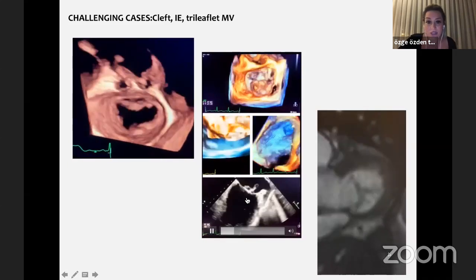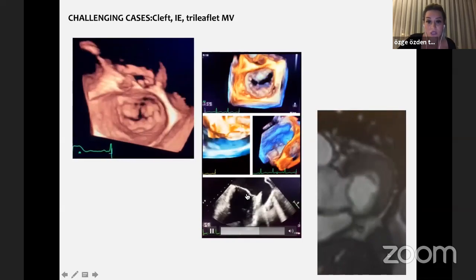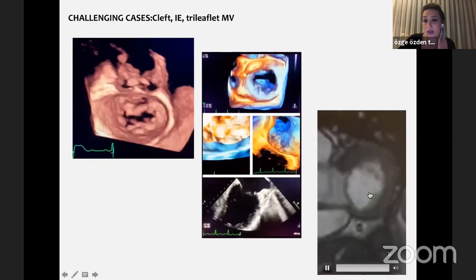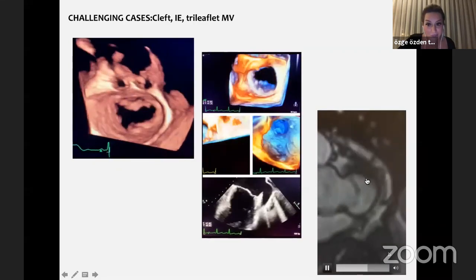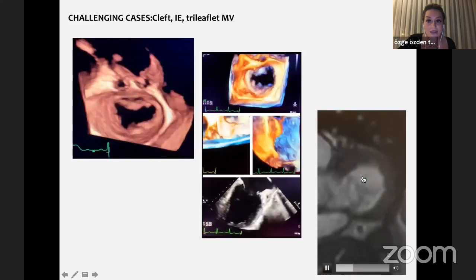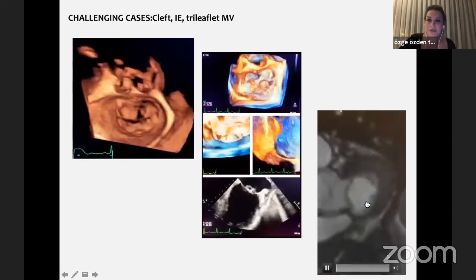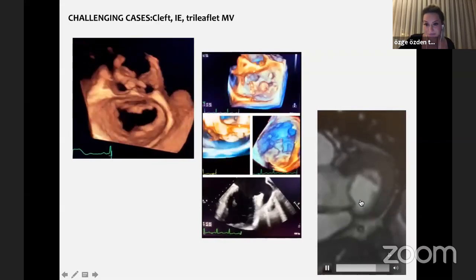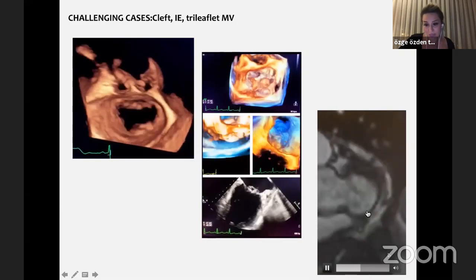This is an infective endocarditis patient. Even with limited image quality on transthoracic or transesophageal echocardiography, we appreciate the vegetation — and of course we cannot perform MitraClip in such patients. This third case in the literature shows what looks like a Mercedes sign when closed, with three leaflets — a CMR scan performed 10 days ago. This patient also had severe MR but is not a good candidate for MitraClip; we must analyze the valve perfectly.